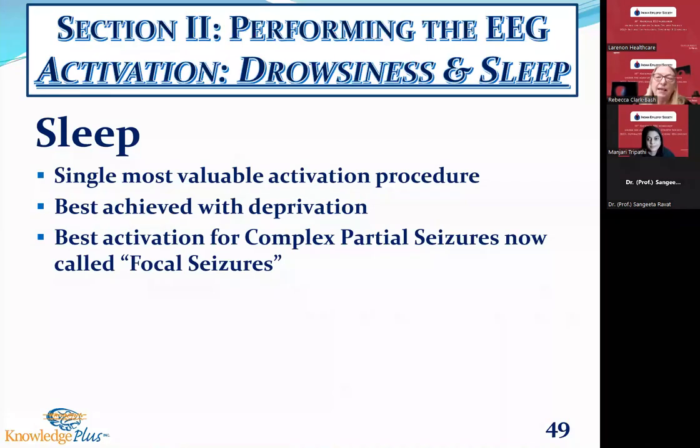Now, the next big recommendation I have is this: other staff in the department need to know it is not acceptable to come into my exam room where I'm doing my EEG while I'm doing the test. If the secretary or anybody opens that door and they're almost asleep, they're going to wake up and not go back to sleep. So there has to be a sleep test in session. Do not enter the room.